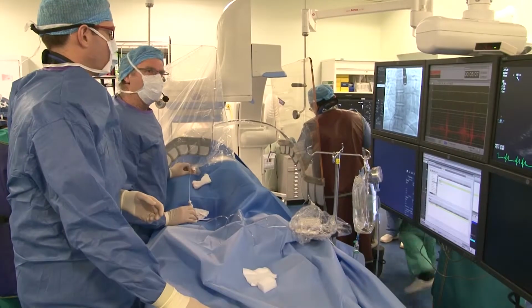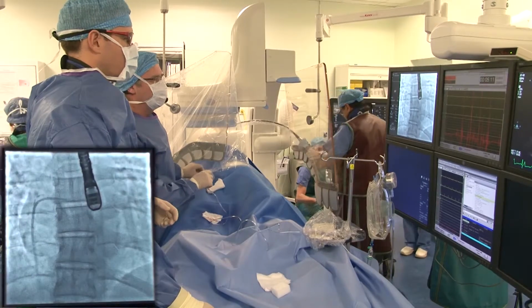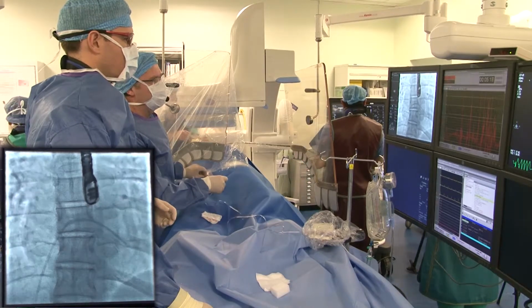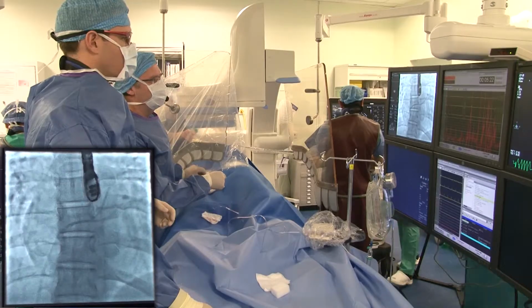We generally start with right heart cath. We just check the pulmonary artery pressure. I've stopped doing a saturation run. You can see we just put a loop in it across the tricuspid valve, and then when we're in the right ventricle, we just pop it up in the pulmonary artery.